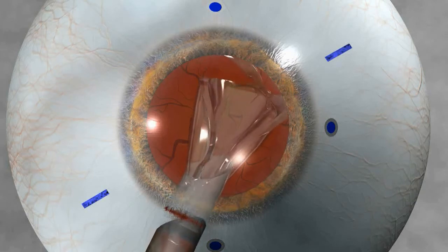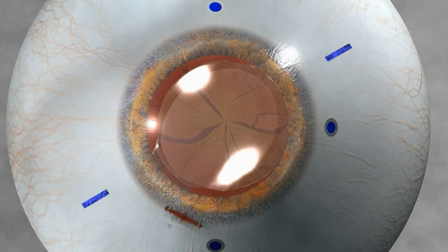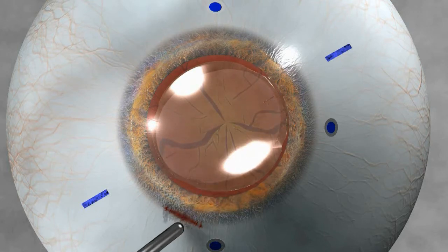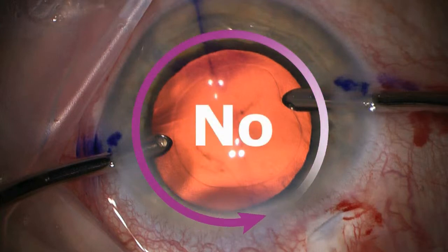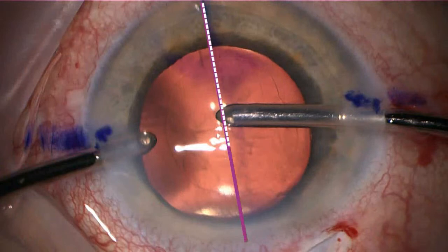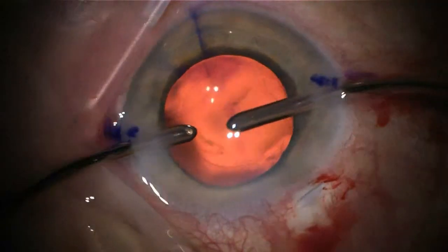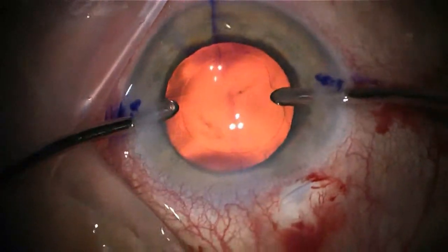After implanting the biflex toric implant in the eye, as with any biflex lens, the surgeon places the IOL aligning the marks of the biflex toric lens with the axis marked on the cornea. Surgeons should always remember to rotate the implant clockwise while in the capsular bag to align it with the right axis. Once the lens is about 15 to 20 degrees from its final intended position, the surgeon removes the remaining viscoelastic gel, then gently rotates the lens to its final position, checking that the lines of the biflex toric are aligned with the steep axis marked on the cornea.